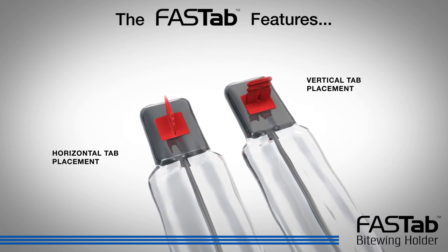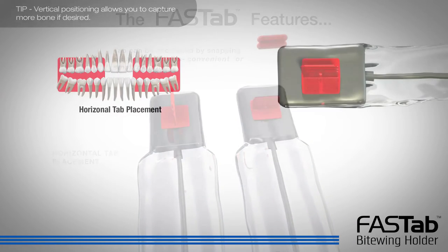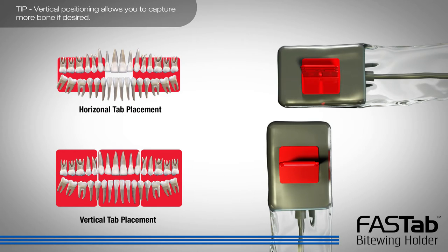If desired, the tab can be shortened by snapping off at the indentation marks. The bite wing holder can be positioned in a horizontal or vertical orientation.